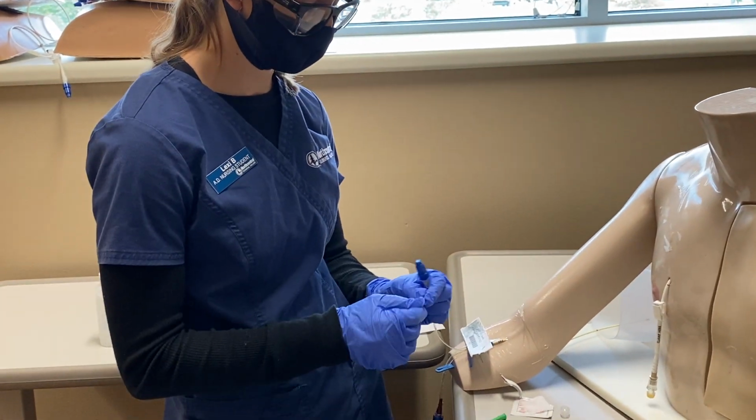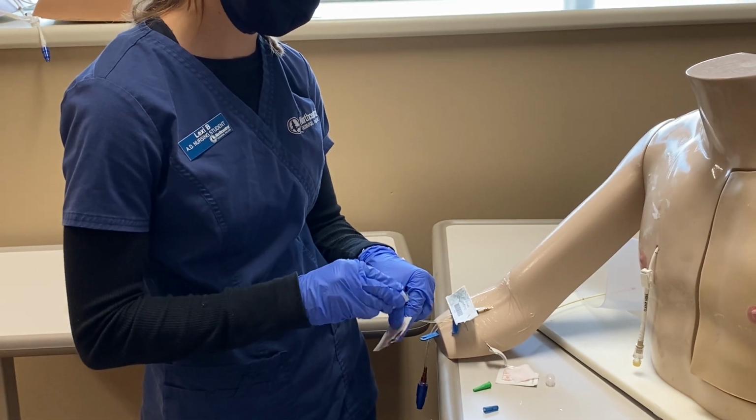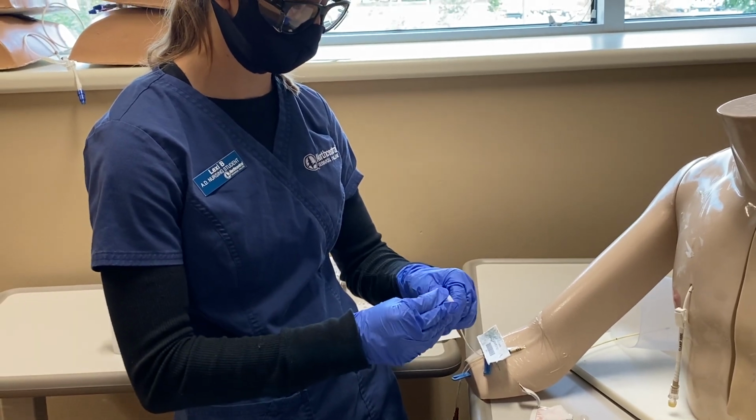And a final wipe for the last normal saline. The hydromorphone is compatible with normal saline. I looked in my buddy book. I'm going to give them that over 2 to 3 minutes. There's no need for dilution.